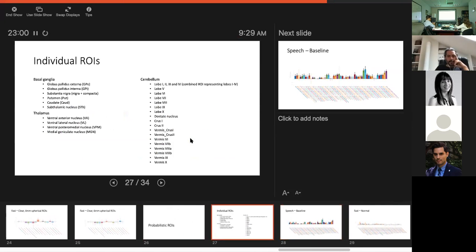And are these defined at the group level? Yeah, so these are, again, MNI template. Okay, MNI space. Do you have a plot by any chance of these regions, to see the probability and how it levels off at the borders? That's a good question. I should actually say that even though these were derived from a probabilistic atlas, I was actually using the binary mask. Oh, okay.